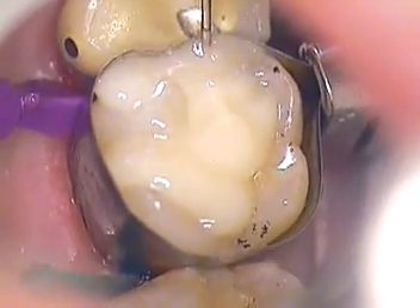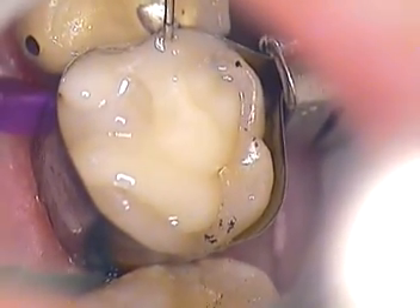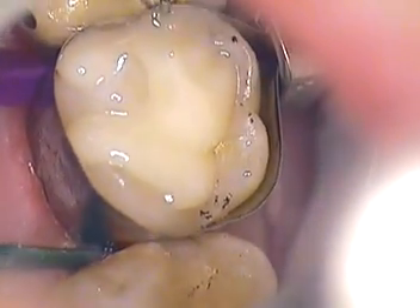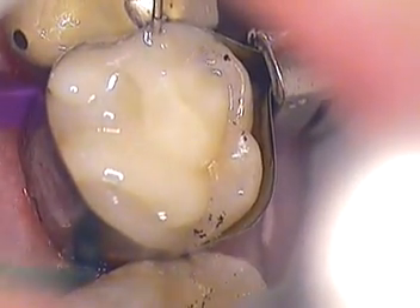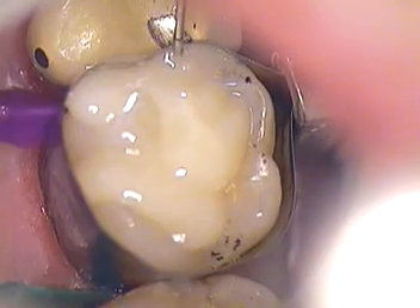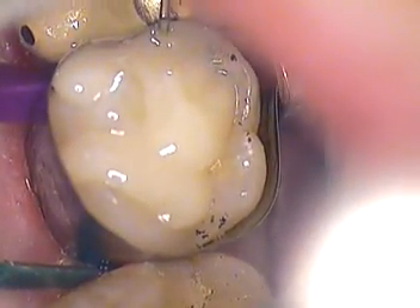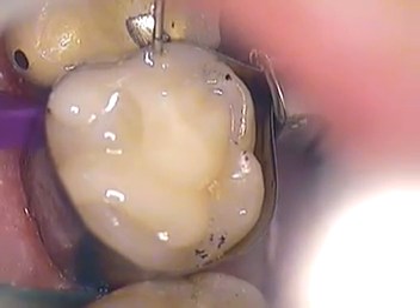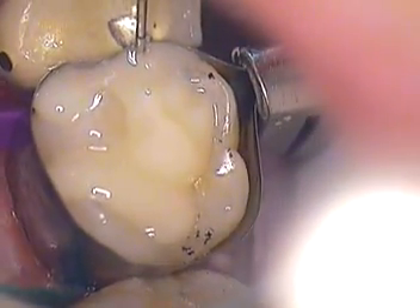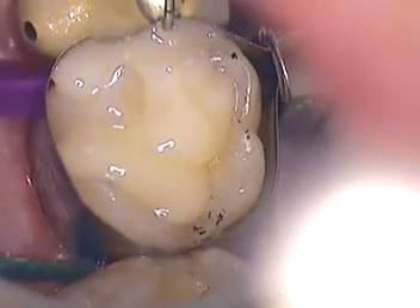One of the nice things about using a microscope is that these tunnel preparations are not easy — you can't do them all the time. You may have a fracture in the enamel or some other problem where you can't use them. But with a microscope you can actually go in and see so much more — see what's undermining the enamel, go in and take it out, clean it out, and stay conservative.